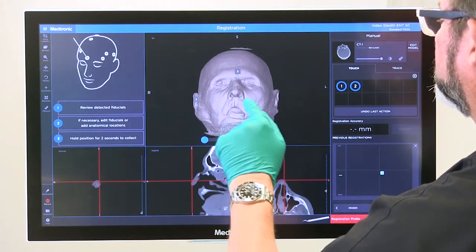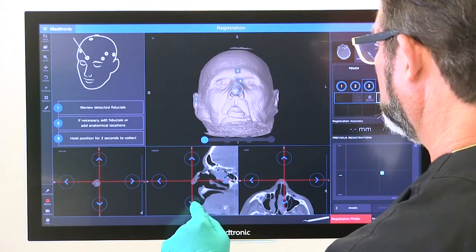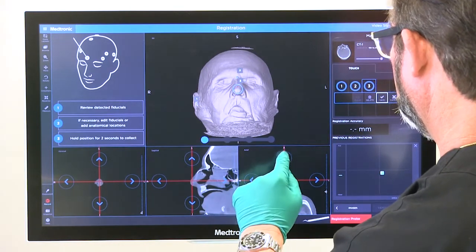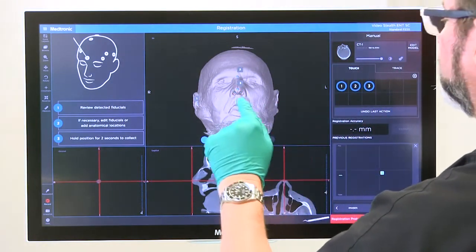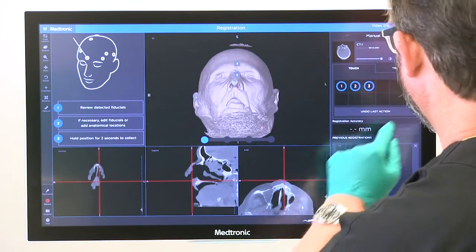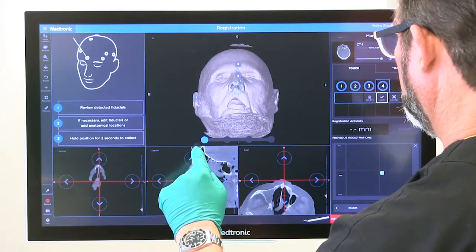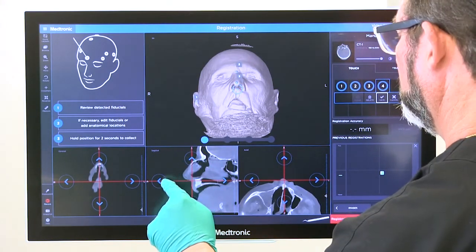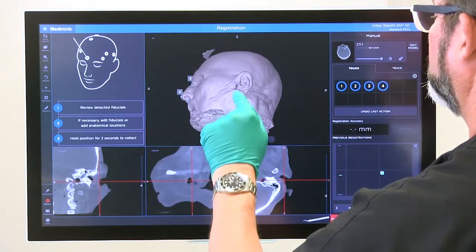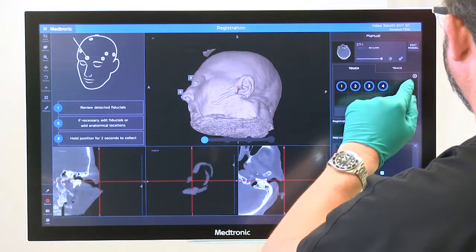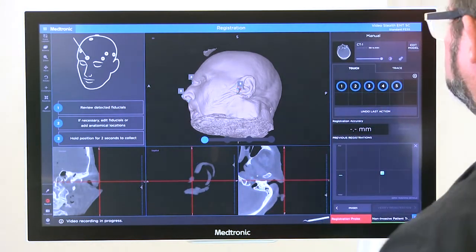The tip of the nose. And our other tragus.